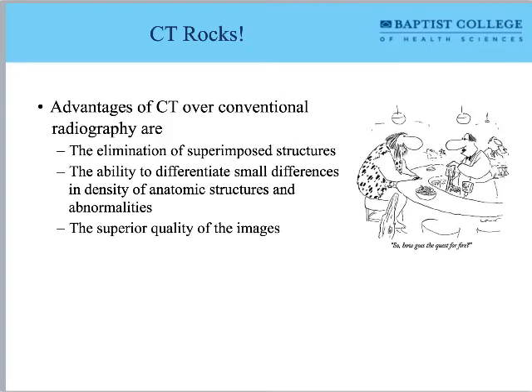Then we started to ask some weird questions. What happens if you start spinning around while you're banging the rocks together? That is the fundamental question of CT. If you have an X-ray tube, what happens if you get really wild and crazy one night and start spinning it around your head like this? That's the question. So we got a little bit up on our game.